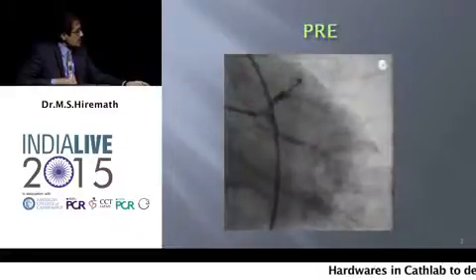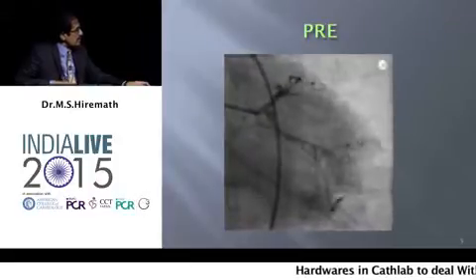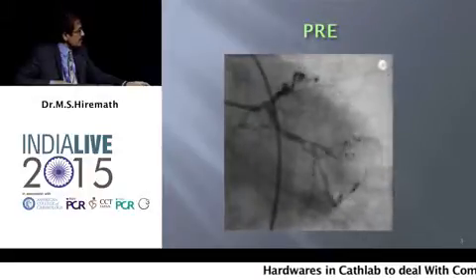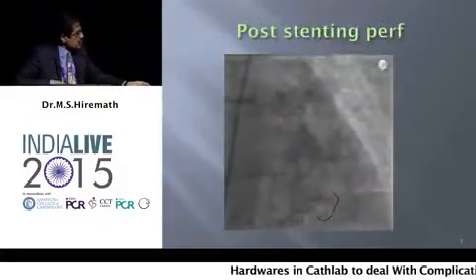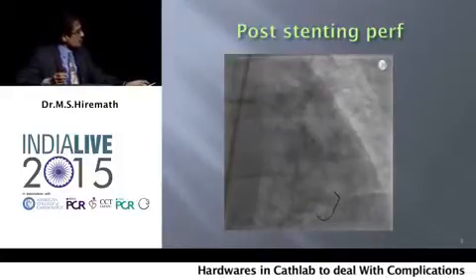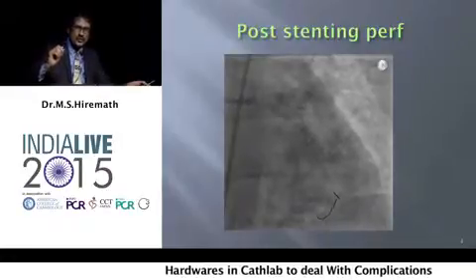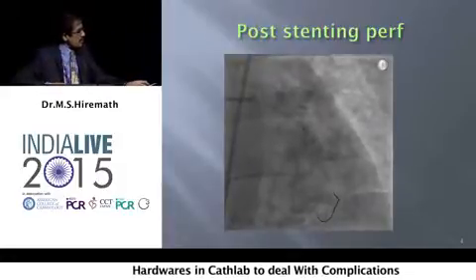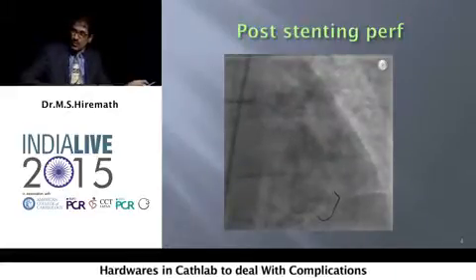Look at this case. We had a complex 1-0-0 kind of bifurcation. Can we run it again? We did a stenting in the main vessel. Run it again. And you can see I never withdraw the balloon unless I'm quite sure I've taken a picture. So many times I put a nitroglycerin down. So you take a post-dilatation balloon, deflate, put a contrast down, make sure there is no perforation, and then only withdraw the balloon. So in this particular case, something wrong.